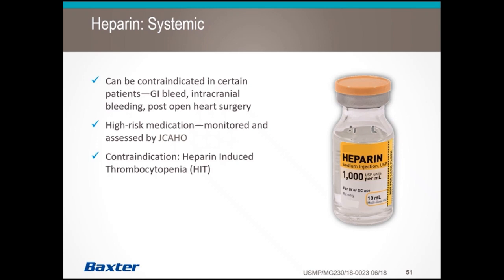Other means of anticoagulation can be pre-filter dilution of your fluids, diluting fluids before they go into the filter. That can be accomplished with pre-filter replacement solution, and then also other forms of anticoagulation other than heparin, and that would all be based on your hospital's policy and protocol on how the physician plans to anticoagulate during CRRT therapy. But basically, just remember that the KDIGO guidelines do recommend anticoagulation in CRRT for patients who have no contraindication and who aren't already on a systemic anticoagulant.